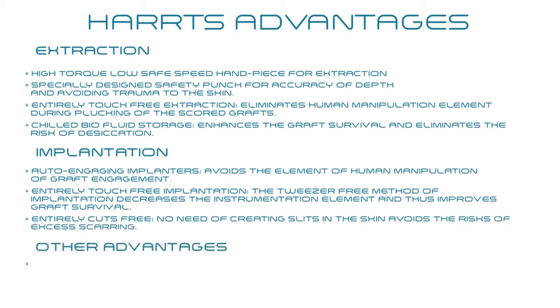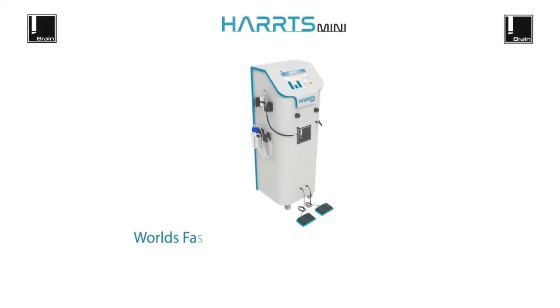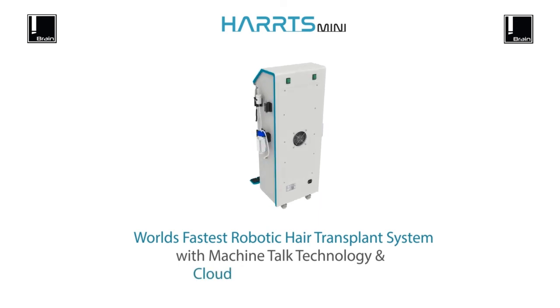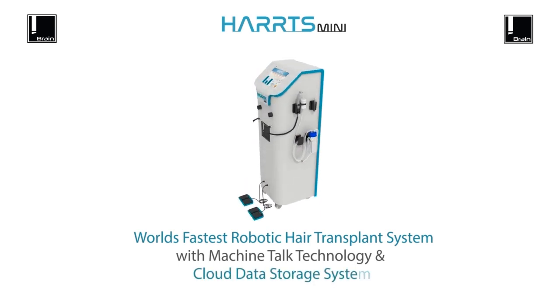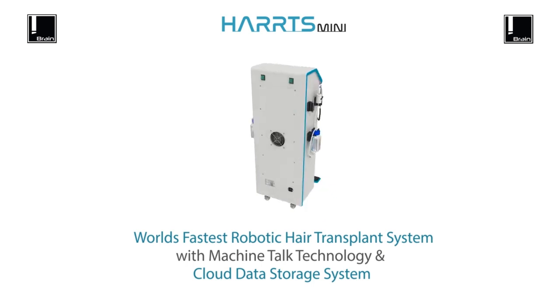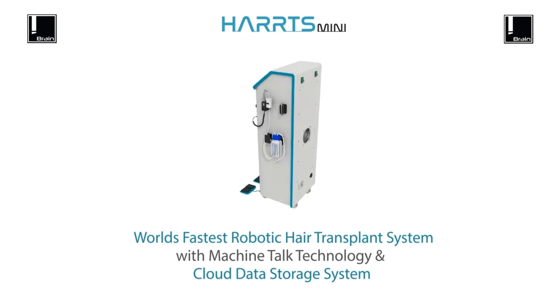Other advantages include machine talk interface and cloud-based data management system. HARRTS Mini — the world's fastest robotic hair transplant system with machine talk technology and cloud data storage. HARRTS — revolutionizing the way hair transplants are done today.